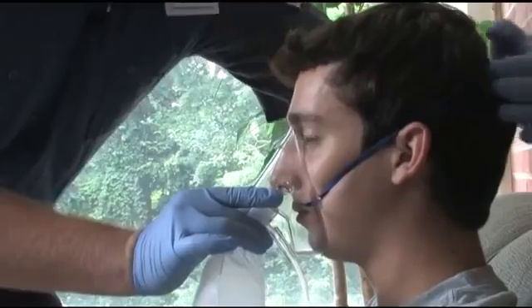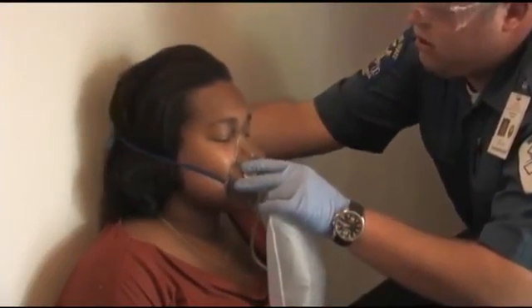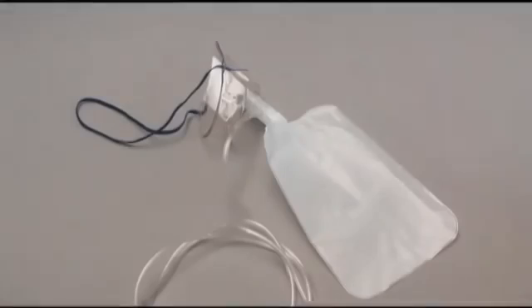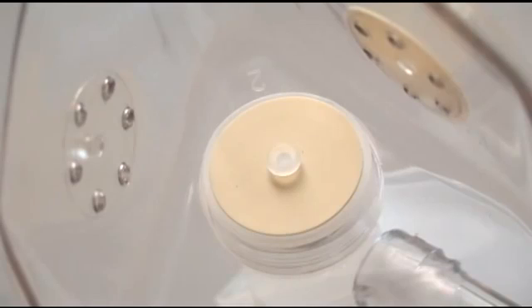Cyanosis, cool, clammy skin, shortness of breath, chest pain, severe injuries, altered mental status, or a pulse oximetry reading below 90%. The device delivers oxygen by an attached reservoir bag connected to the mask with a one-way valve.